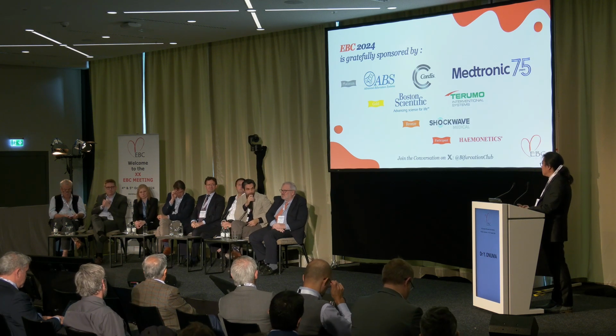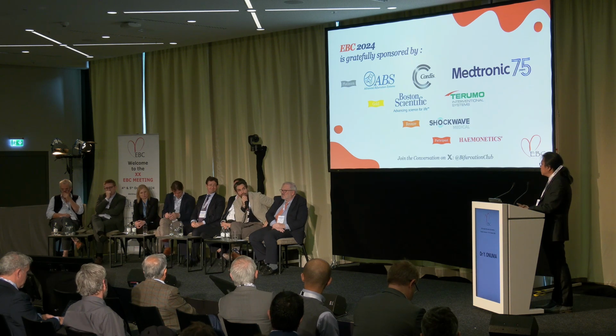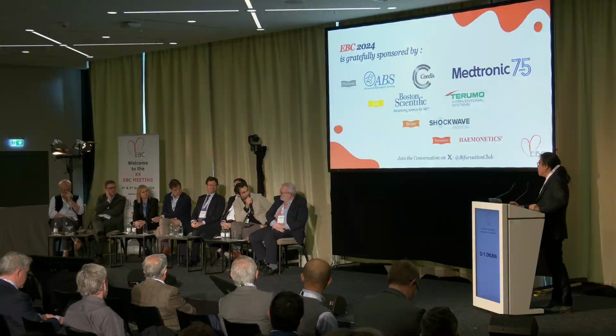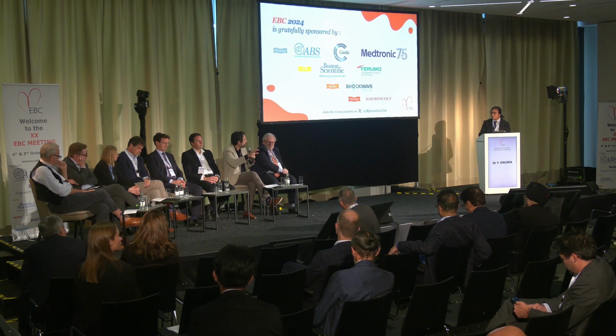Yoshi, thank you very much. That was a very comprehensive presentation. And I have to say that I was a bit shocked when you showed the correlation plots, because even removing the points on the 0.5 line, which we know is because the FFR-CT cannot go beyond that, you see that the scatter is significant. And although you have a mean difference that appears to be low, the limits of agreement are huge. You have almost 50 points within the limits of agreement, basically meaning that 68% of the data will have a difference of 0.15 or something.